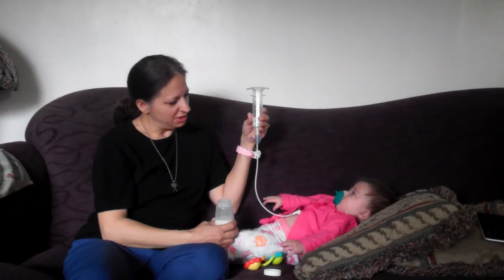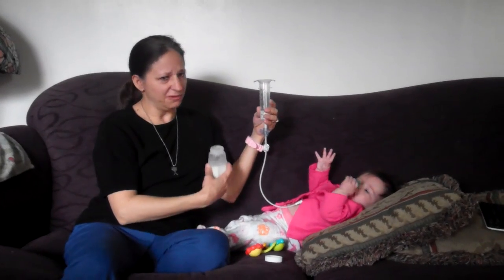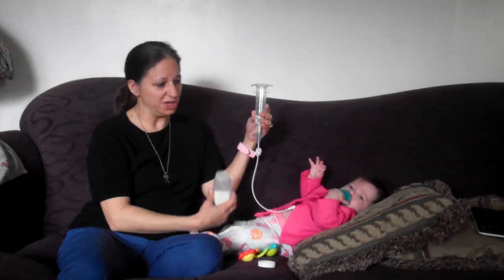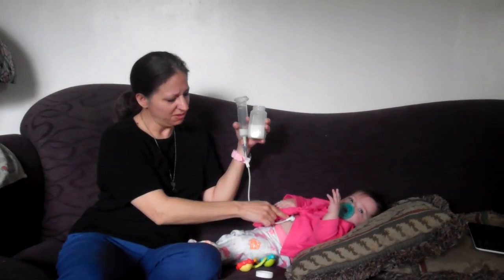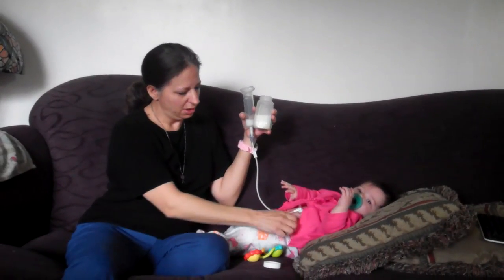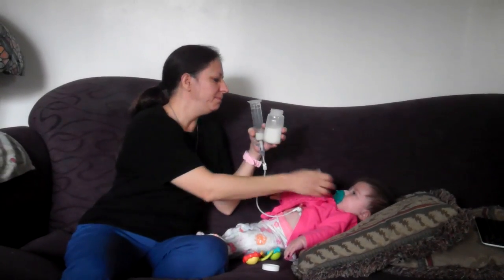But she's doing good, and because of her fundoplication surgery, that's the reason I have her more in an upright position. Again, I try to feed her while I'm holding her sometimes, but then her hands are everywhere and she's grabbing at the tube, and I don't want her to pull it out of her stomach. With hers, this one is called the Mickey button, and there's like a little balloon in there with just a little bit of water, and it kind of holds it down in there. But yeah, she's doing fine. And so maybe I'll take her binky again.